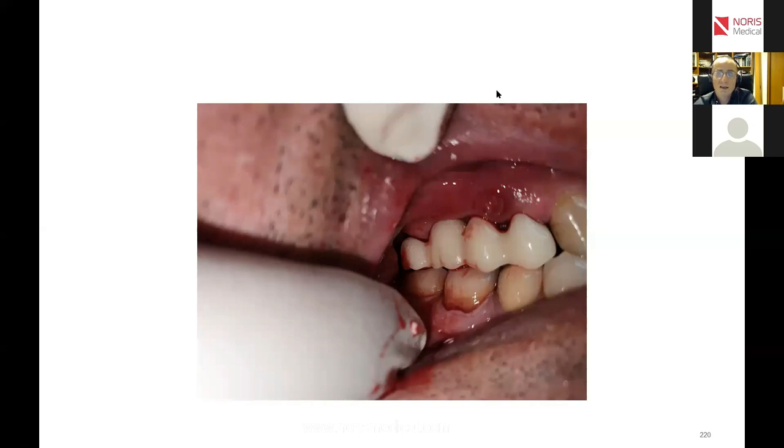Well, I'm asked here by Dr. Mohamed Alubayat, what is the maximum torque for bendable implant insertion? A very good question. Of course, it depends a little bit on the neck. The second generation of the implant that we did avoids the problem of breaking necks when you insert the implant and you think that the implant goes in, but actually you bend the neck in strong bone.